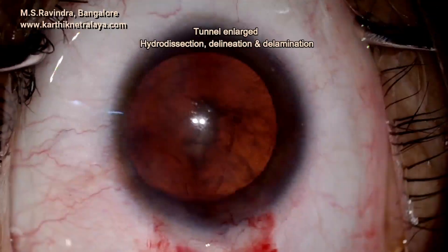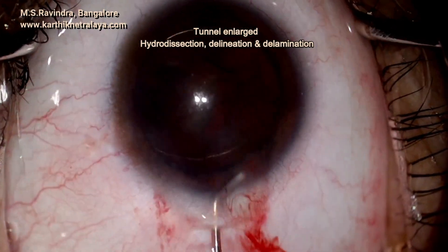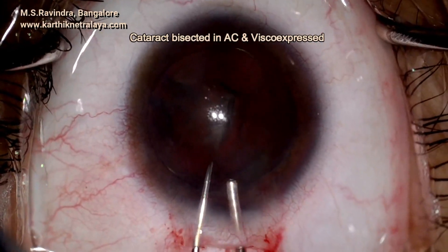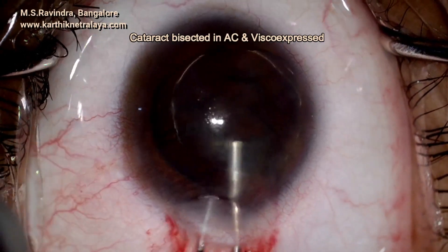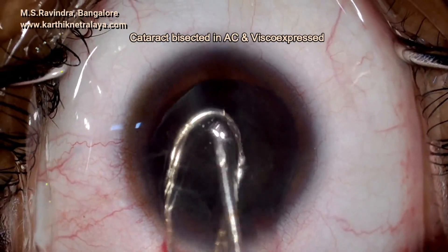The lens nucleus and epinucleus are rotated within the capsular bag and prolapsed into the anterior chamber manually. Then it is bisected using a mini vectis and a 25-gauge cannula, which continuously injects viscoelastic into the anterior chamber to separate the moving nucleus from the endothelium.